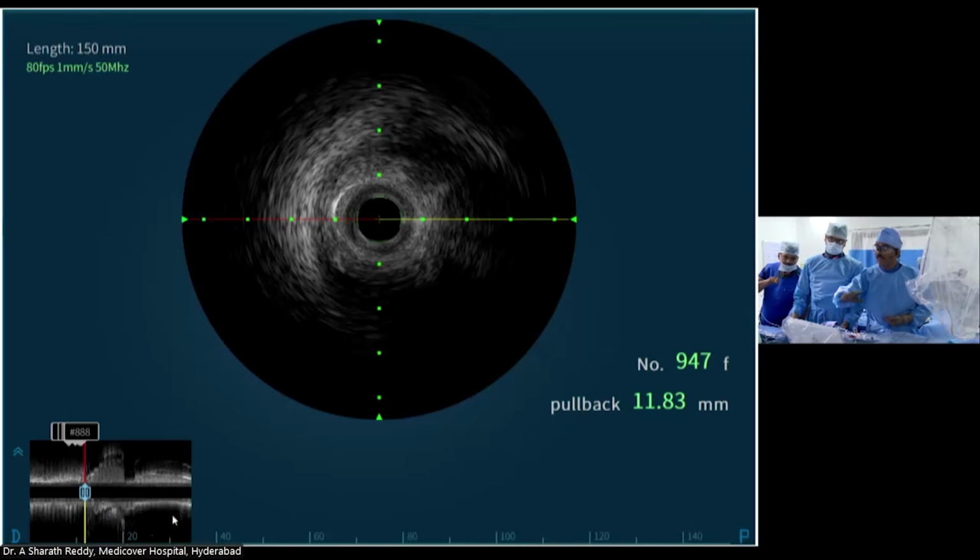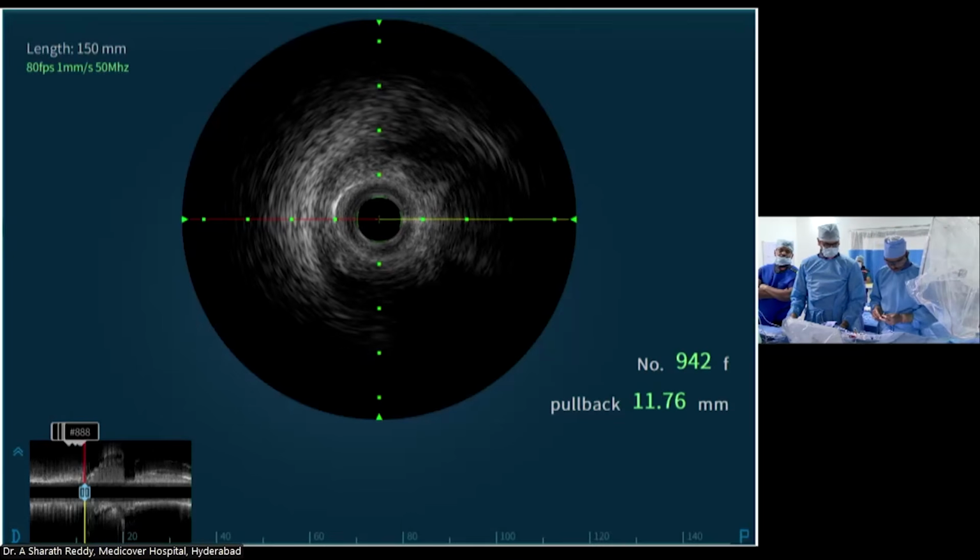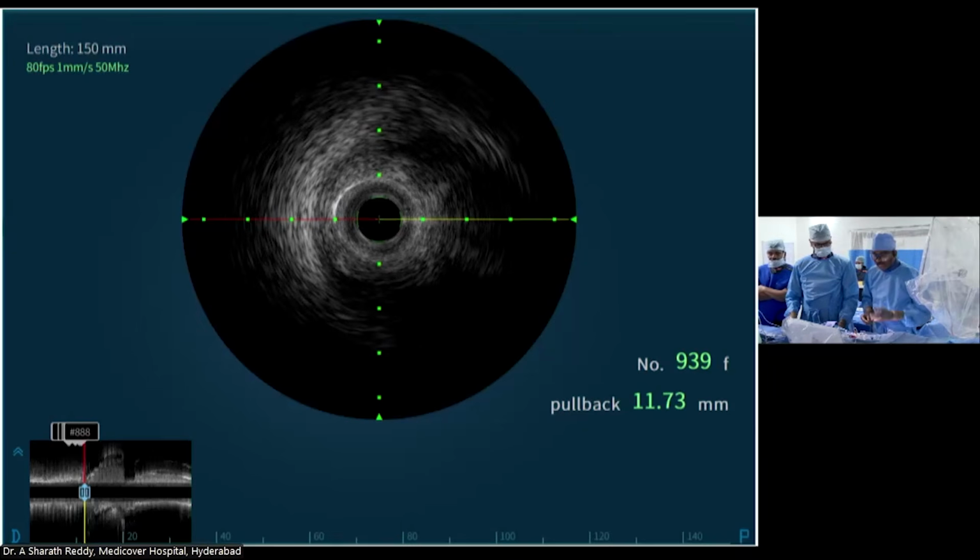But the wire was just going into that branch. And as I already showed you in IVUS, both the proximal cap and the branch are sitting at the same angle. But you had a view where you told us, you tried for 5 minutes, and you could have used a dual lumen catheter in that position to puncture right in this direction.